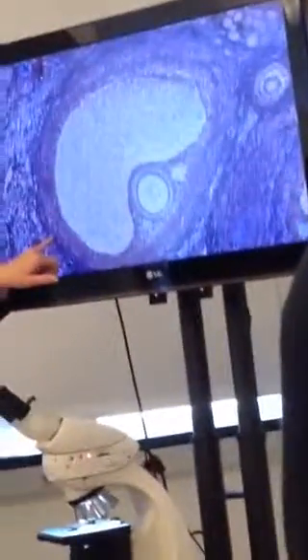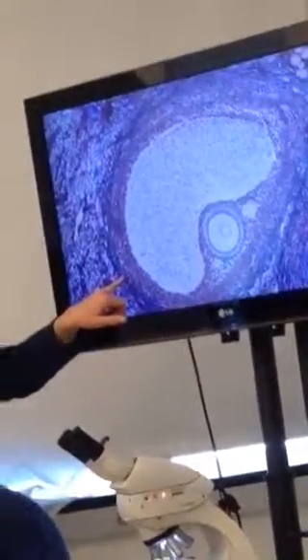Okay, so that's the ovary slide. It's identifying these different follicles. So on your lab practical, I'll probably tell you it's an ovary slide. I'm going to have to zoom in usually so you can see these things, and I'll just ask you to identify the follicle, or in this case, what's that cavity called? What are these cells called?